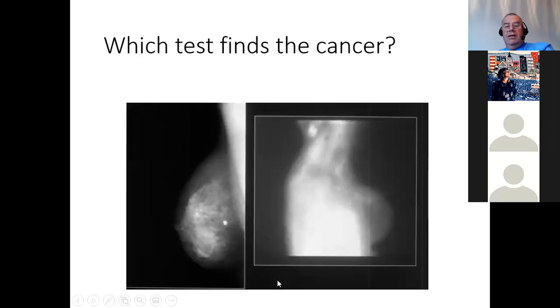Now, here is a patient. The other thing to remember, a bit like kidneys, is that emission is different from transmission. The breast points the other direction in an emission image because you're imaging what's coming out, not what's going through. So here we have a mammogram of a patient with quite dense breasts, and you can't really see very much except the glandular tissue, and there's a bit of calcification, but it's not microcalcification, so it's not considered malignant.